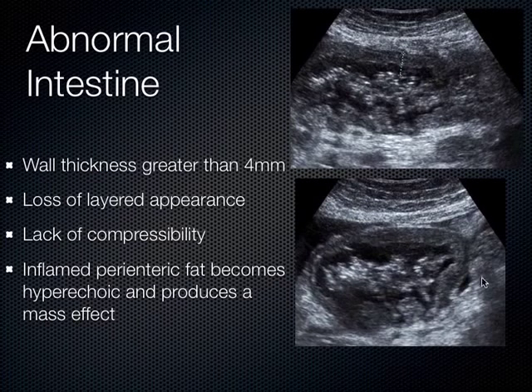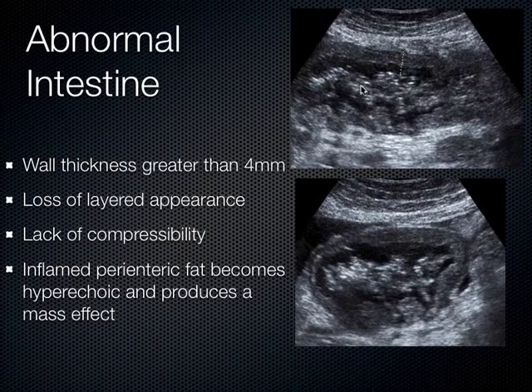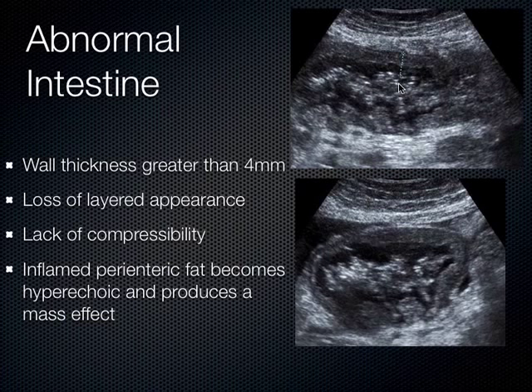This is what abnormal intestine looks like. The wall starts on the outer rim and extends down until you get to the lumen. Air and fecal contents reside in the lumen. You measure from the outer wall down to where the air starts. In normal individuals, less than 4 millimeters. When you have abnormal bowel, you get loss of the layered appearance — everything kind of starts to get stuck together.